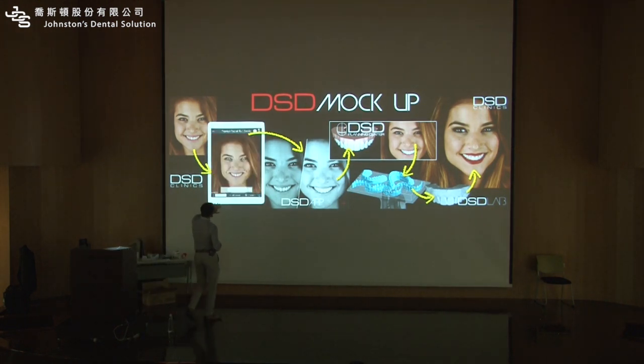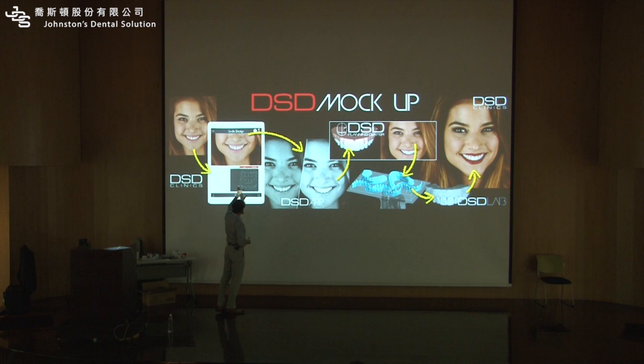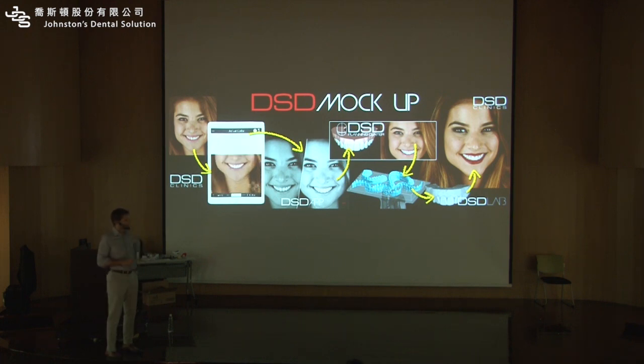You can make the simulation and then do the before and after, or as I usually do, I take a picture from before, put the mock-up in, take a picture from after, and then in the app I make these super nice filters, black and white, texture, and then if the patient gives us permission, we post on social media immediately. Okay?